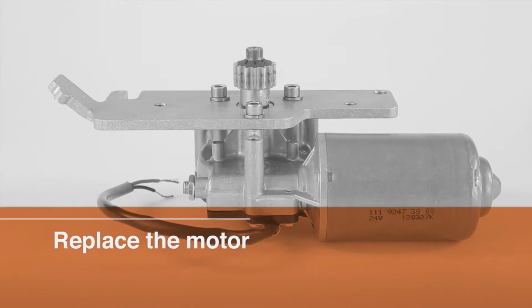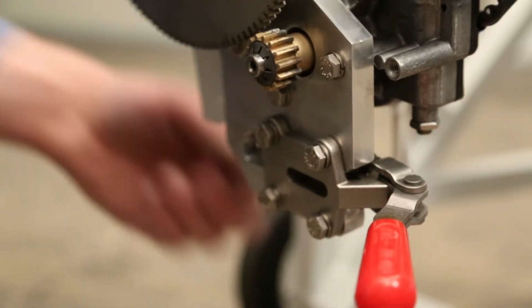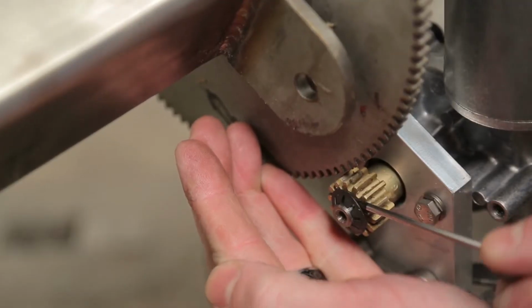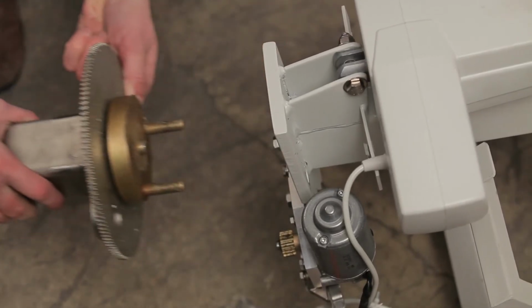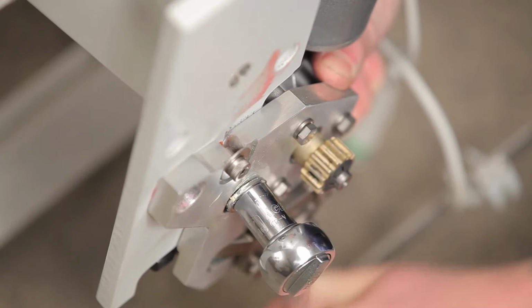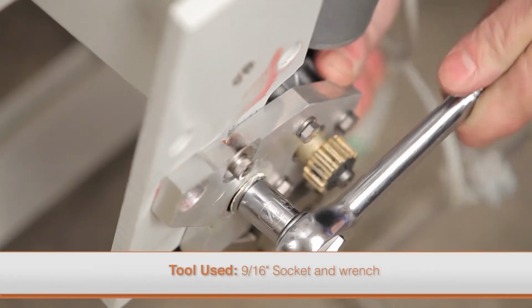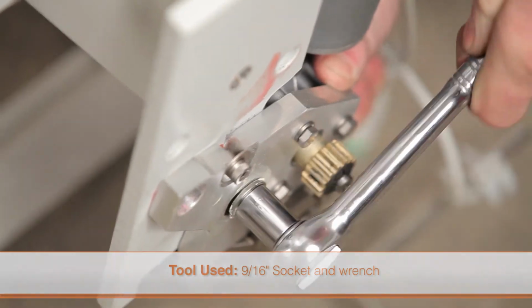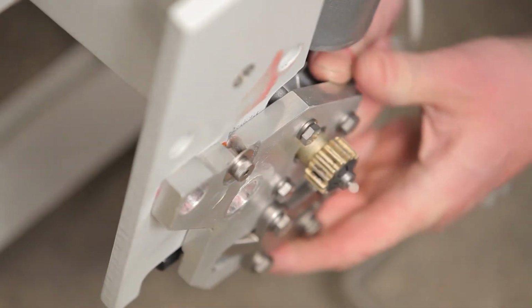To replace the motor assembly, you will need to first remove the small and large gears. Please follow the previous steps we just covered to carefully remove both gears and the hub assembly. To replace the motor, start by removing the two large bolts that attach the motor assembly to the base of the lift using a metric socket wrench. Remove the motor assembly from the base of the lift.